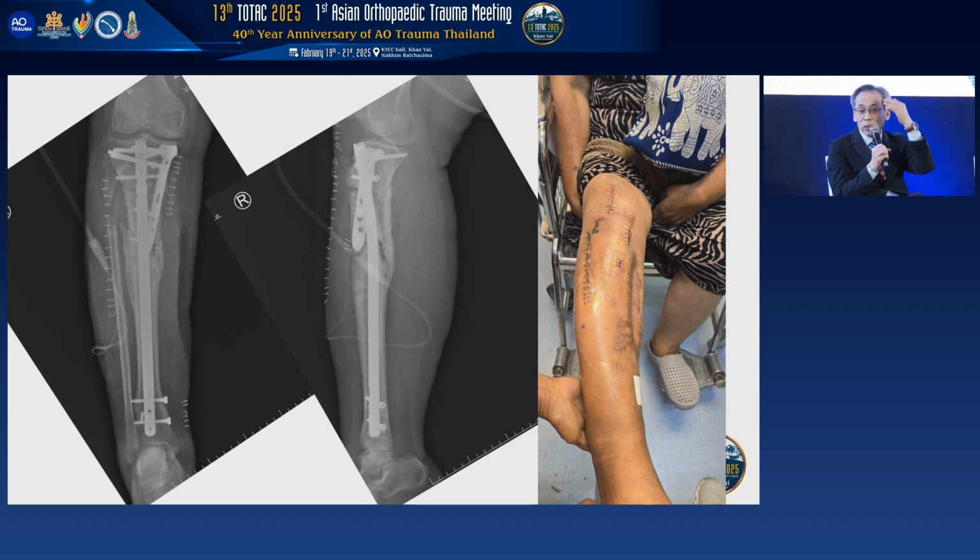So for me, it's a difficult one. If you have already made the entry hole, whether it is a proximal tibia or the proximal femur, you should block the previous entry. The previous holes of the nail pass should be blocked. And then you can direct the nail to the medial side, and then automatically you can correct that deformity.